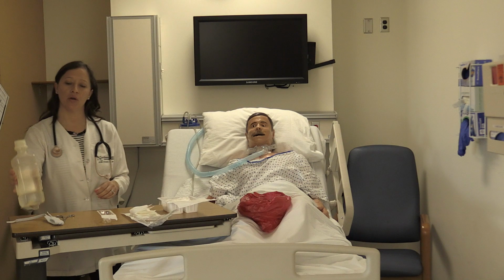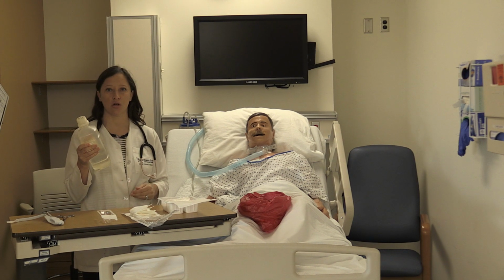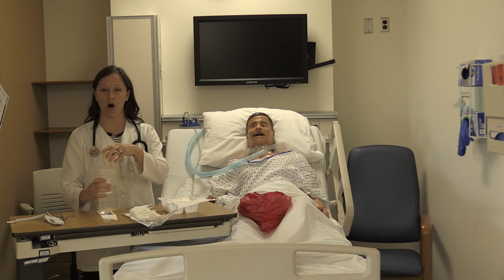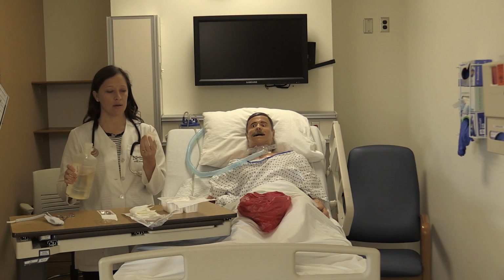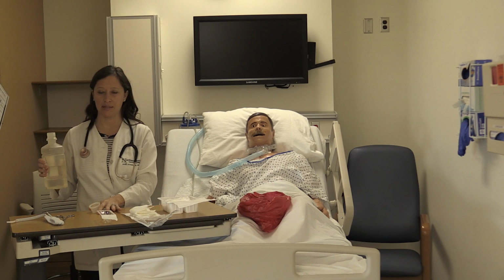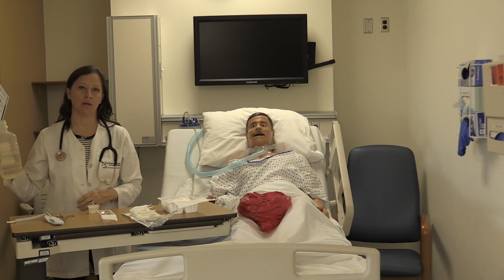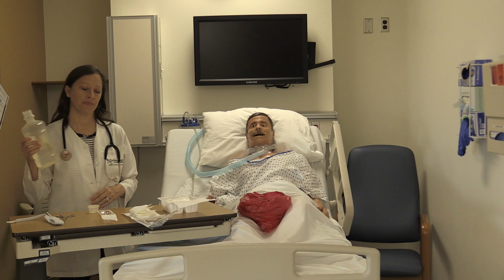You also want to get your sterile water solution that you can use to suction and lubricate your tubing. So you want to palm the label, note the expiration date. You want to open the cap and put it down on the table. And if it's been opened before, you do want to lip it so that you can sterilize the contents.